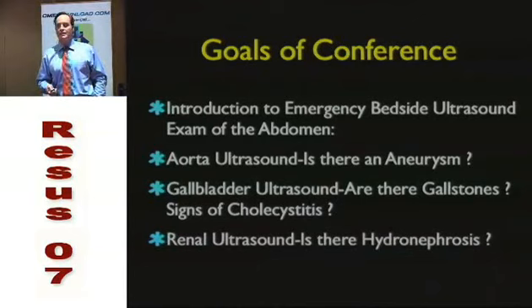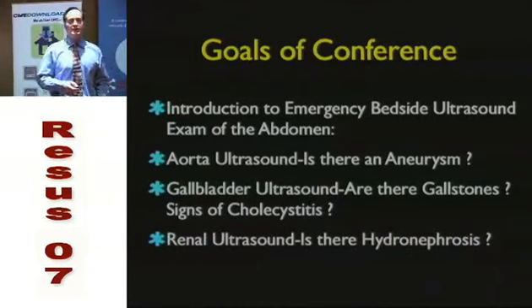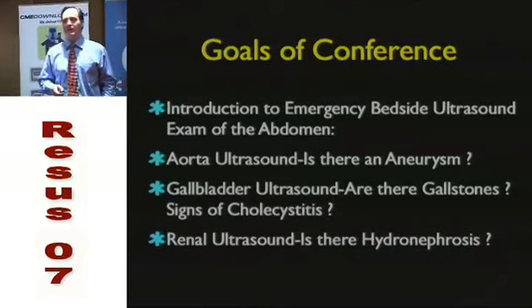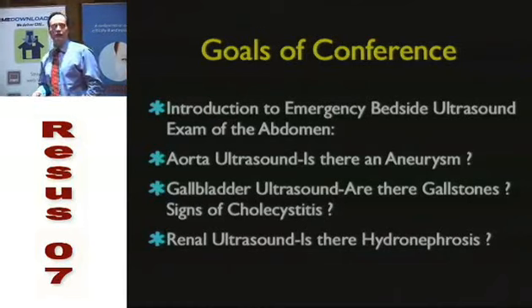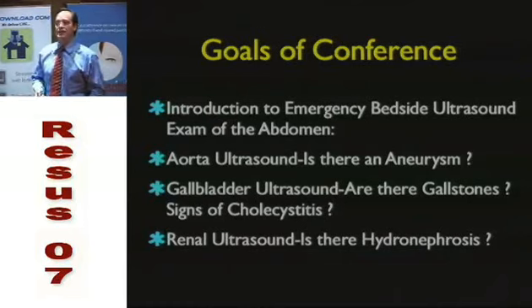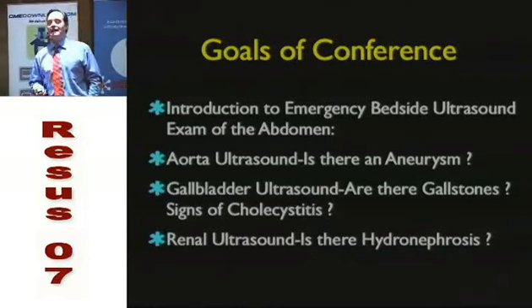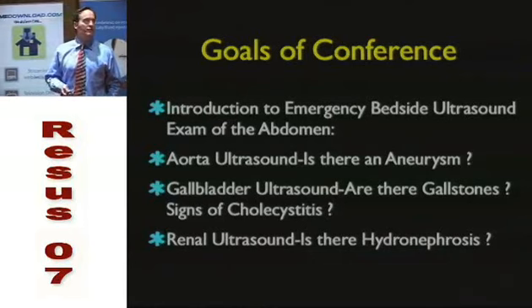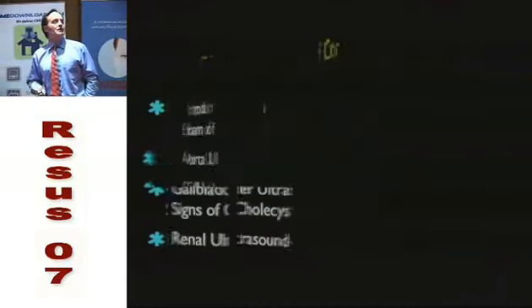Next, how about those flank pains? We talked about trauma a lot in the last talk. In the place I work, we tend to see a lot more flank pains coming in. I can tell you it's about 6 or 7 every shift. And ultrasound offers you another way of managing these patients, perhaps without doing a CAT scan. So with that being said, let's go to the definitive source for emergency medicine education, and let's watch a short clip here.